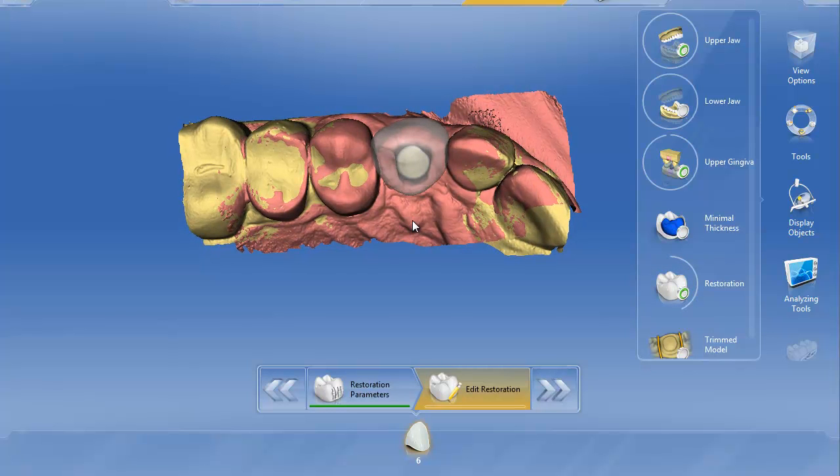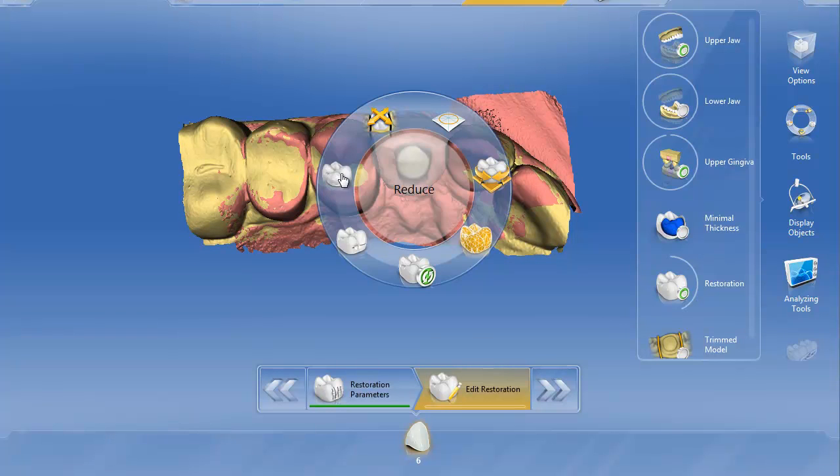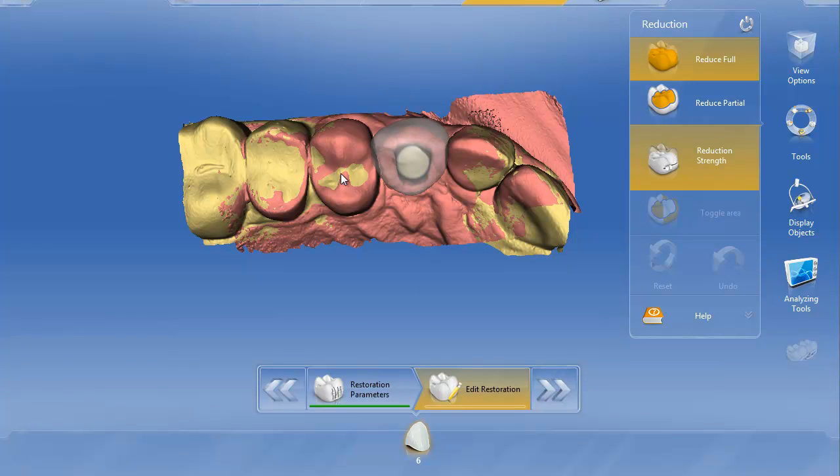You can see that I used the replace function to fill in that little hole. Now we're going to right-click and choose our reduction tool. We're going to choose partial reduction, and we're simply going to demarcate — just like we did in 3.8 — the area we want to reduce.